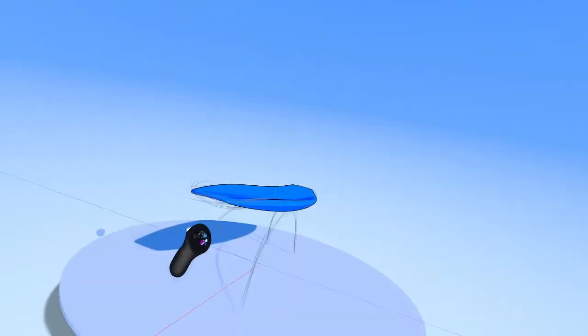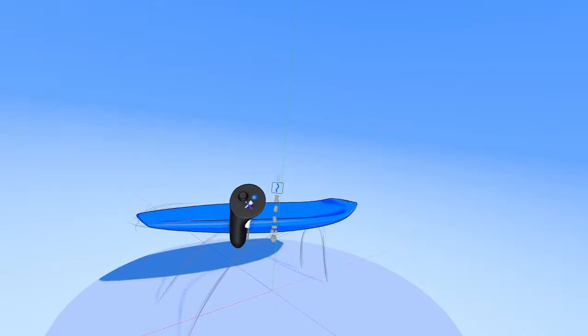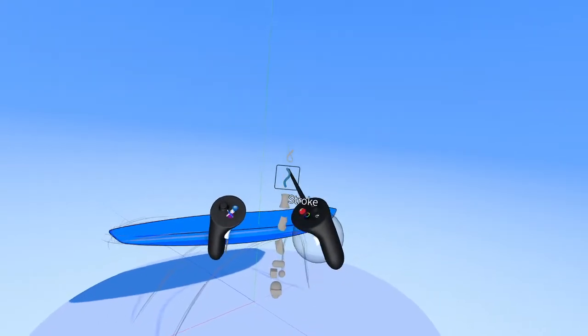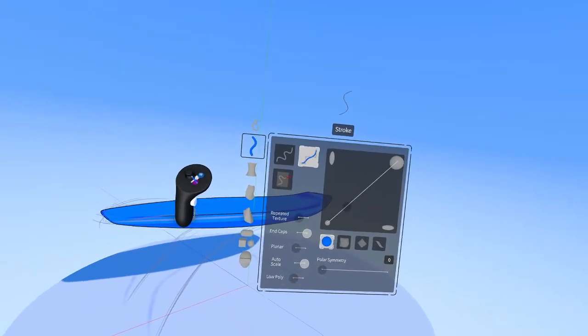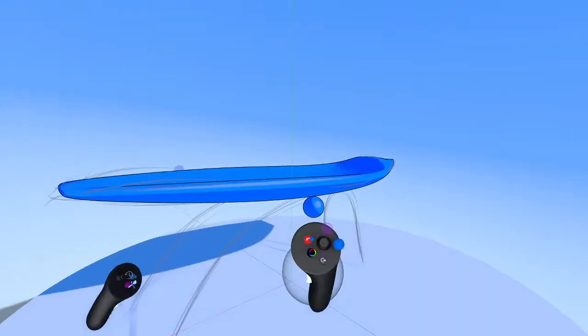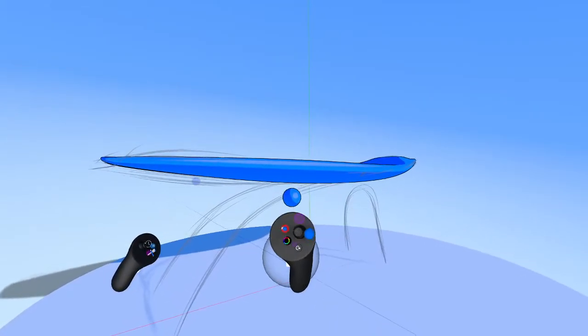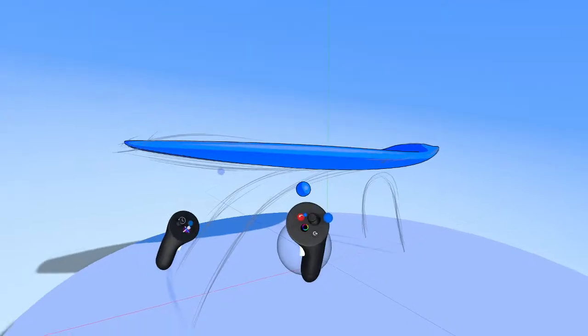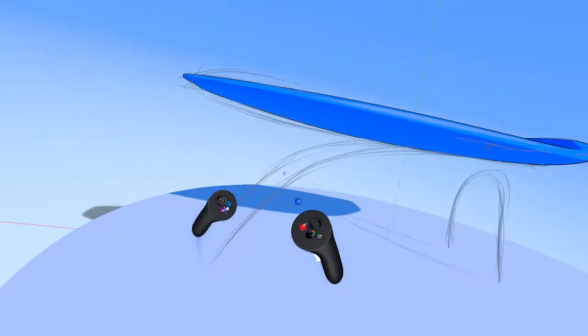All right, now what I'm going to do is actually design the legs here. It's just going to be a simple stand-in. So what we're going to do is, instead of building it out of sub-D geometry, just going to press the purple menu button here, stick with the stroke tool, and turn it on point mode. And then we can close that. So you can adjust the size of your stroke, or the stylus I should say, by going left and right on your joystick. So let's just get something that looks decent. That's good, and we can always adjust it in post.